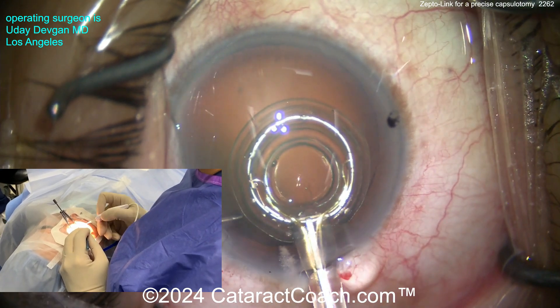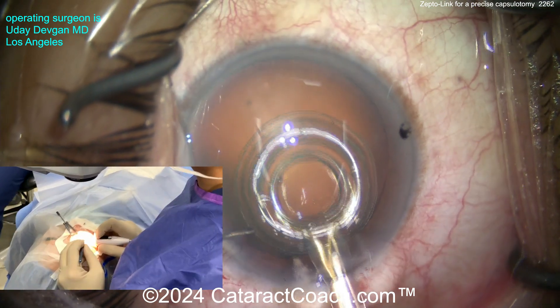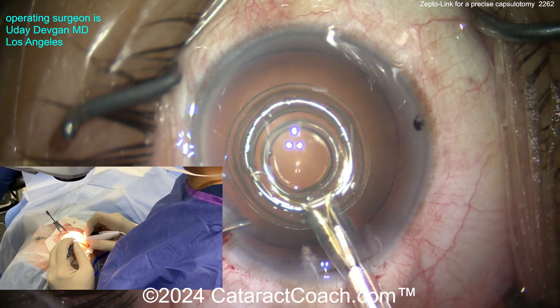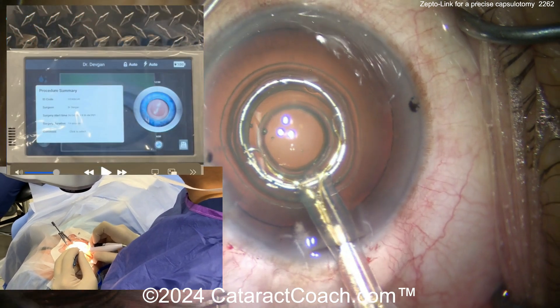Now open it, and you can place this capsulotomy anywhere you want. I'm spending a little time getting it centered exactly where I want it. I'm looking at the Purkinje light images, looking at where it centers up in the eye. That looks pretty good to me.